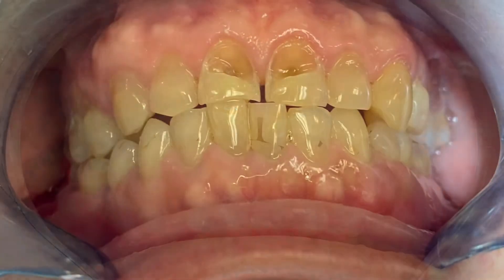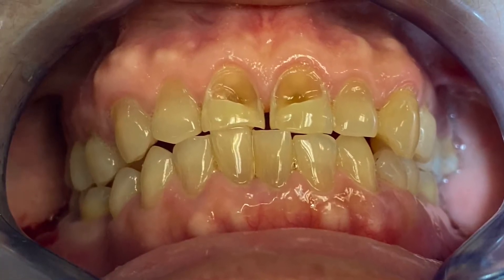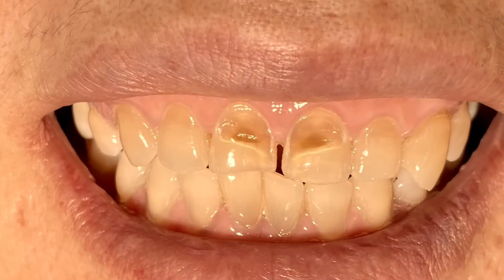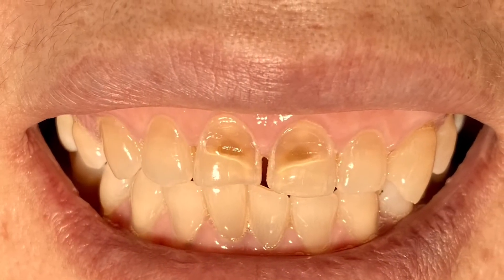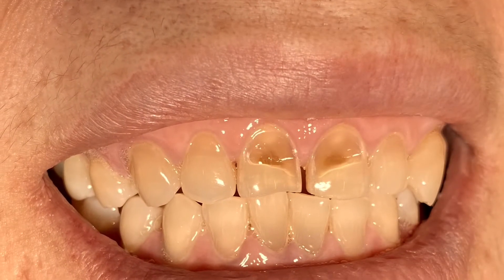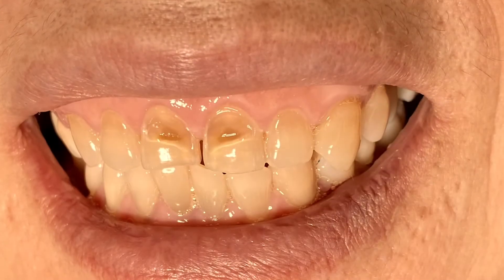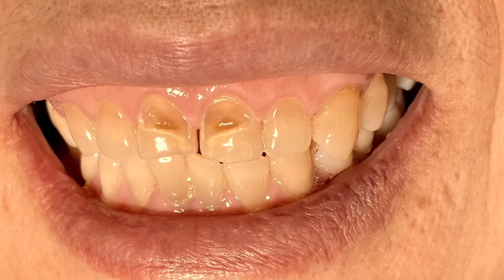I just want to show you guys a simple case that I have the privilege and honor to help one of my patients through dental charity work. This patient has had facial abrasion on teeth number eight and nine for quite some time and doesn't have any insurance.